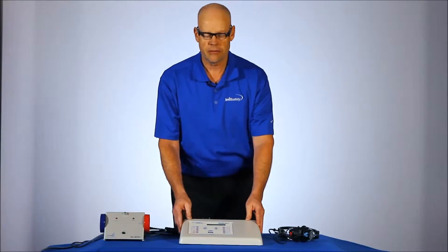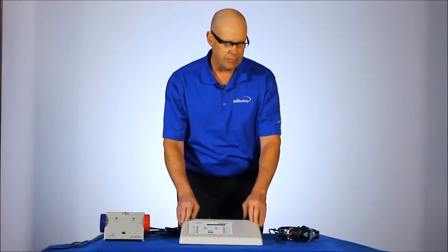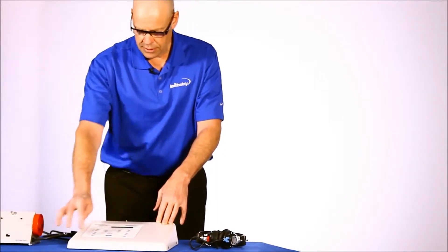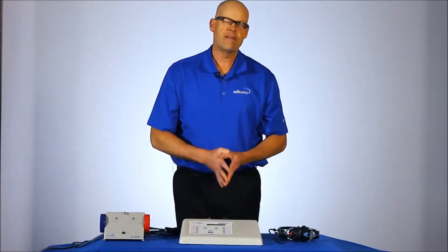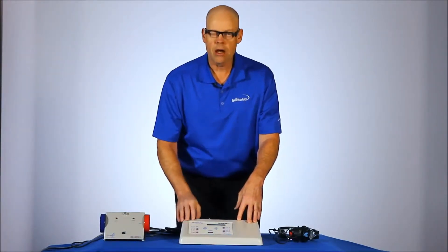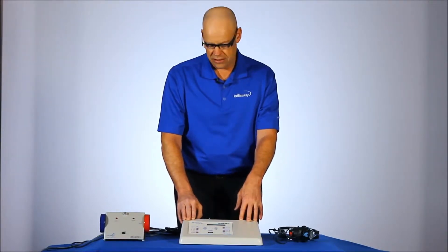The unit I have here is the RA300 Plus, and it is a pure tone automatic and manual audiometer. It has a number of functions built into the device through the 10 keys on the keypad itself. It tests from 500 up to 8,000 Hz, both left and right ear, and there's a built-in talkover function. You can store up to 64 completed tests in the device.